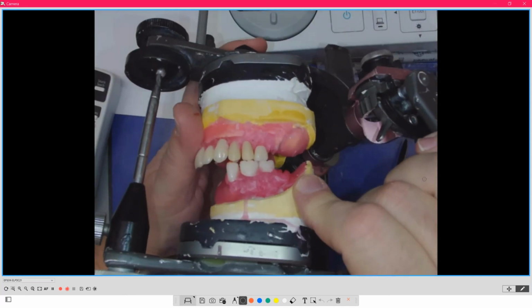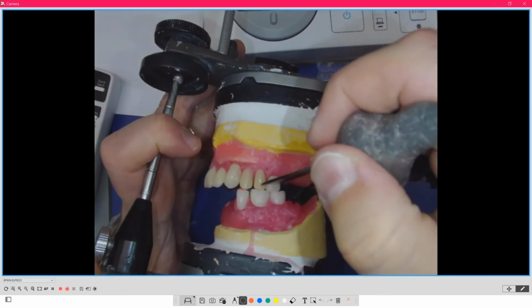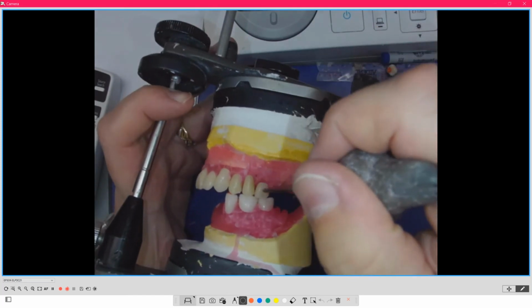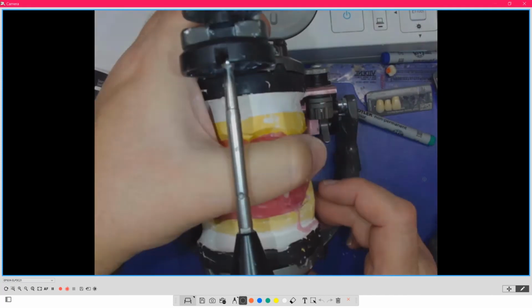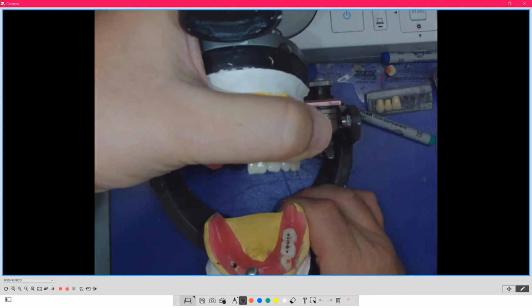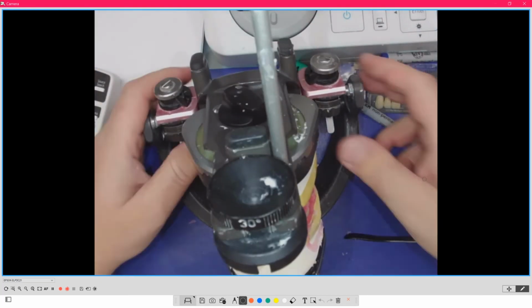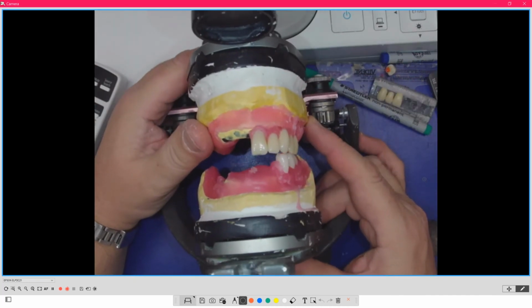And that's what I had to show and even highlight to VITA themselves about the beauty of these teeth. Because now we have this setup. So I've got this kind of quirky setup, and it may not look good to you and I on the workbench, but remember, behind lips, that thing looks normal. It's going to look normal for that patient and that person, yet it's going to function and chew. So now from a chew cycle perspective, I'm going to open the articulator. So remember I said, I don't want to do this.